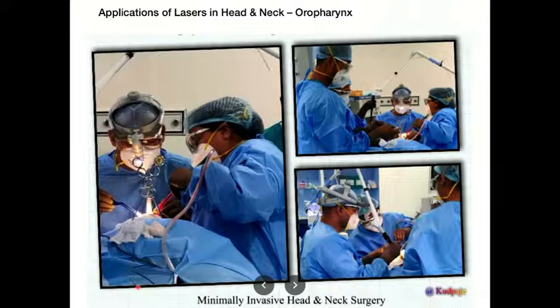You may end up having a tracheoesophageal fistula. You plan your incision so that you are not in the posterior, just cut only the membranous part, and then do a balloon dilatation or simple endotracheal dilatation to get the exposure.